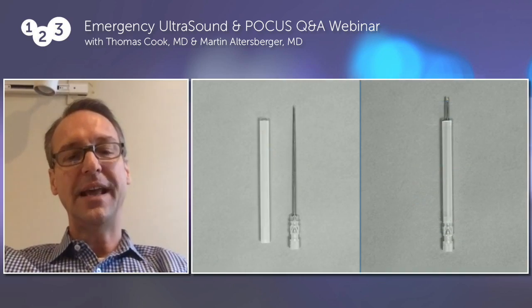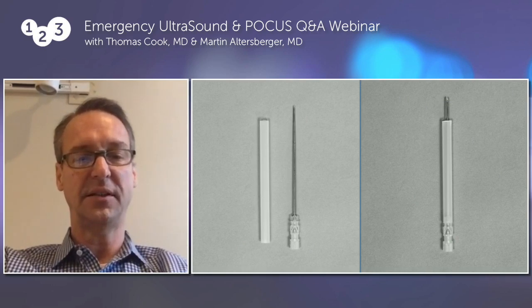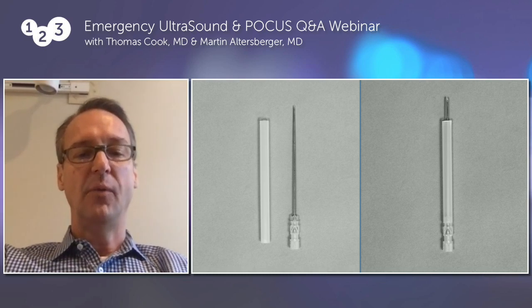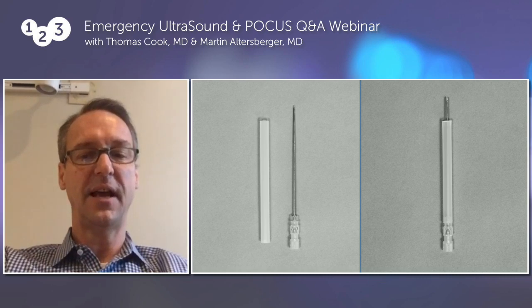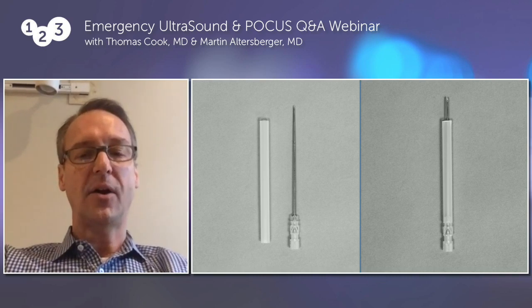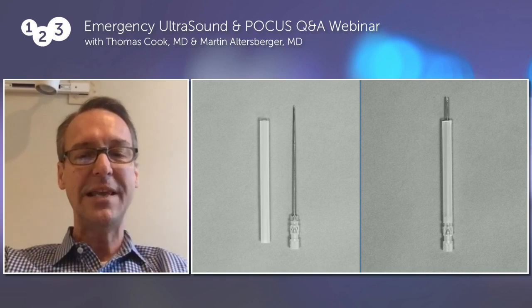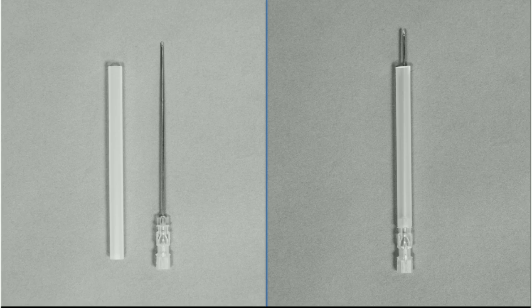And the next tip is probably the most important. We're using a spinal needle, and spinal needles are packaged with that hard plastic sheath that you see there on the left. And what we do is we figure out, based on our ultrasound, how deep we need to go to get the tip of that needle into the abscess. And we will trim that hard plastic cover and then put it back over the needle. So now what we have is a situation where we can't even get close to the carotid artery. It's simply impossible. And this is an extremely important tip for you to avoid complications. So you can see all we do is take a pair of scissors and cut that. And it's really quite elegant when you can do that and you feel comfortable that you're not going to hurt your patient.